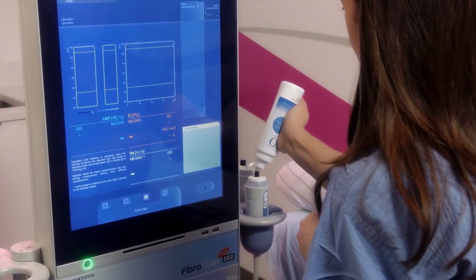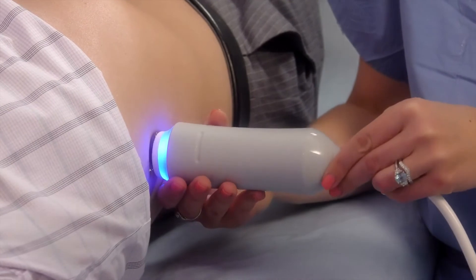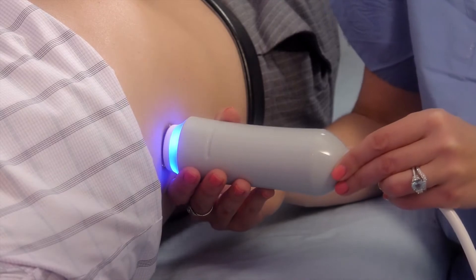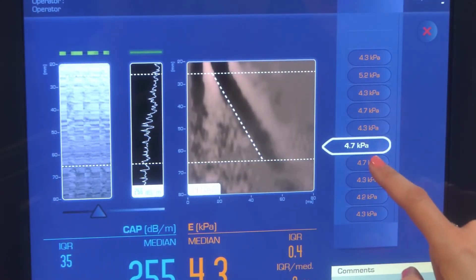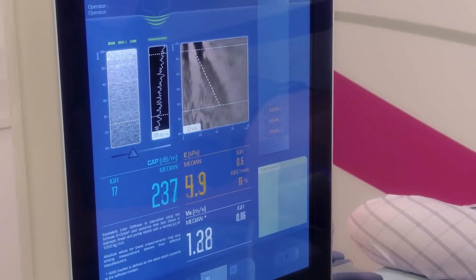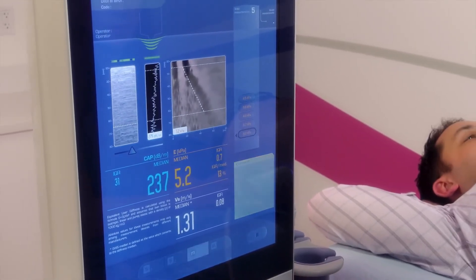After applying a water-based gel to the tip of the probe, the operator will position the probe in the space between your ribs. You will feel a slight pressure and a slight flick against your skin when the shear wave is created — about 10 flicks as part of the examination. Fibroscan will record the measurements and the results will be provided to your physician, who will interpret the data according to your personal medical history as part of an overall assessment of your liver health.